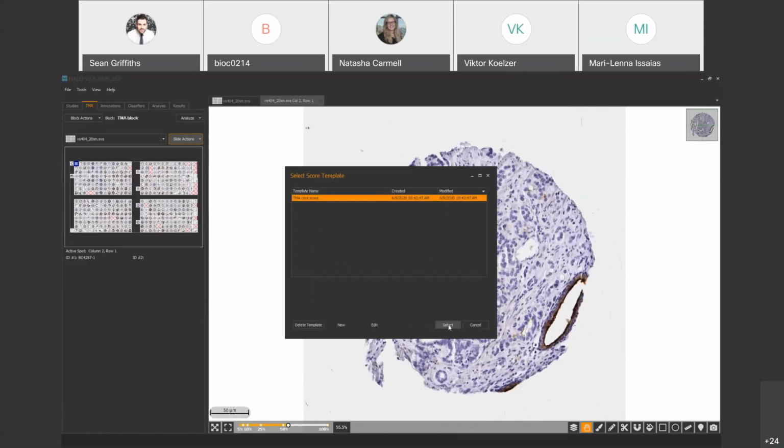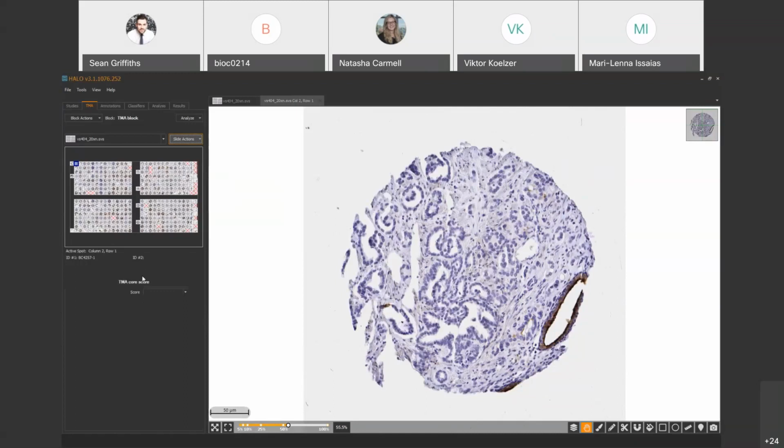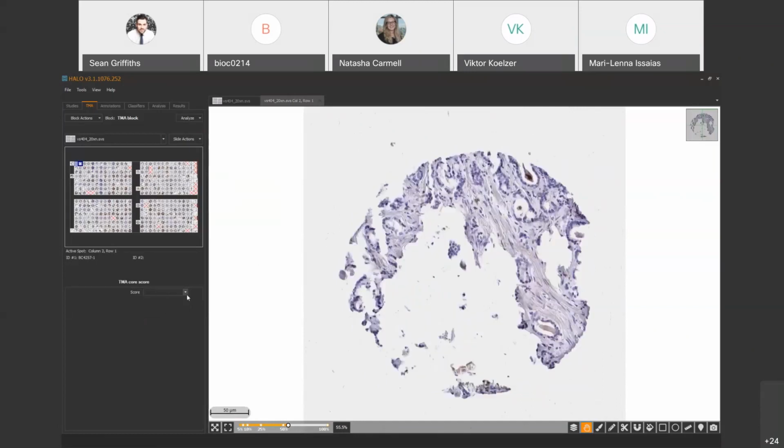And if I then select this template, a little window appears down here, and the user can come in and select some options. You could add custom text or a description of the core. It'll be saved to the database, but instead I can just select it like so. Select a score. Maybe that one will be 1+. Move on to the next one, and that is a scoring template. Please feel free to have a play and make the scoring templates as you see fit.